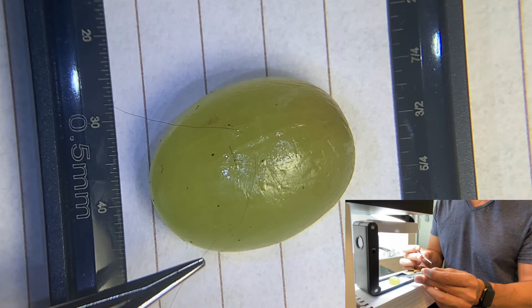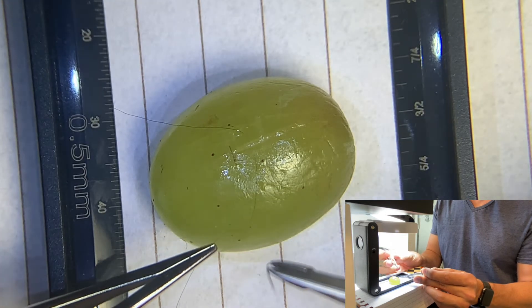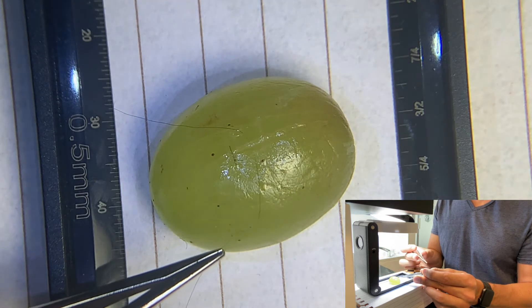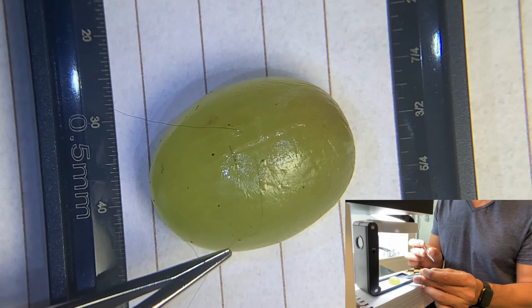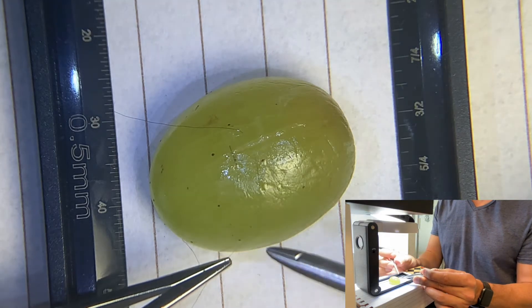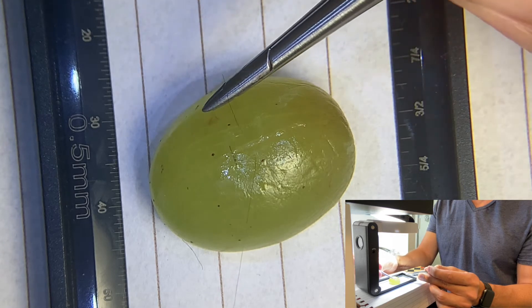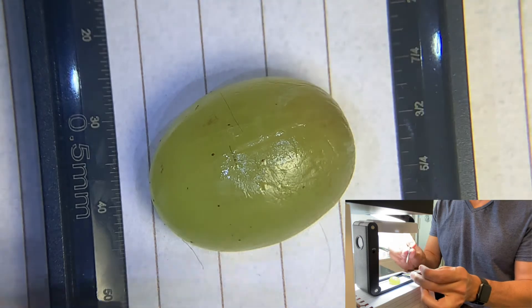Now I'm letting go, and you'll notice that the suture is still attached — still magnetized, or maybe just adherent. I want to hold it tightly with my second instrument. I've let go with my needle driver, and now I continue to pull towards my chest and it will fall off. I pull more and more until I get the tail at the length I want. I like short tails — that'll save you some suture.